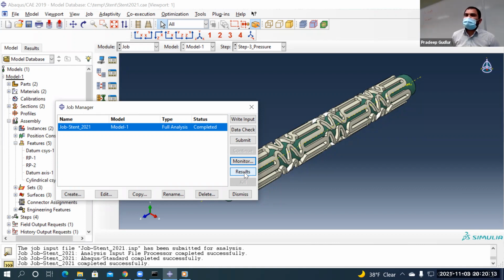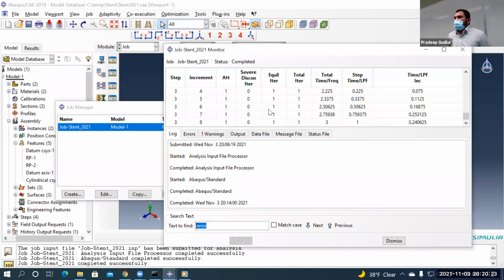So let me know, guys, when you are complete. So does the animation make sense to you? Slow down the animation, so you can see the three steps: the expansion, contraction, and the pressure step. It should still retain its shape.